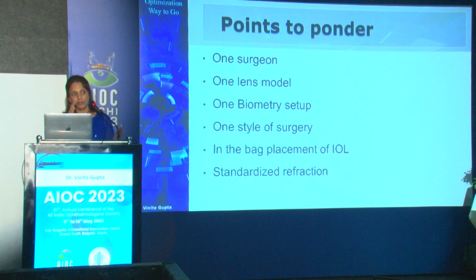Also, when you have to optimize, please remember, a single surgeon has to optimize. You cannot take data of other people and optimize your constants. So: single surgeon, single lens model, single biometry machine, one style of surgery. You cannot combine a temporal incision and a superior incision and take those results to calculate your own constants. In the placement of the IOL, you cannot combine in-the-bag and sulcus placement cases together, no.